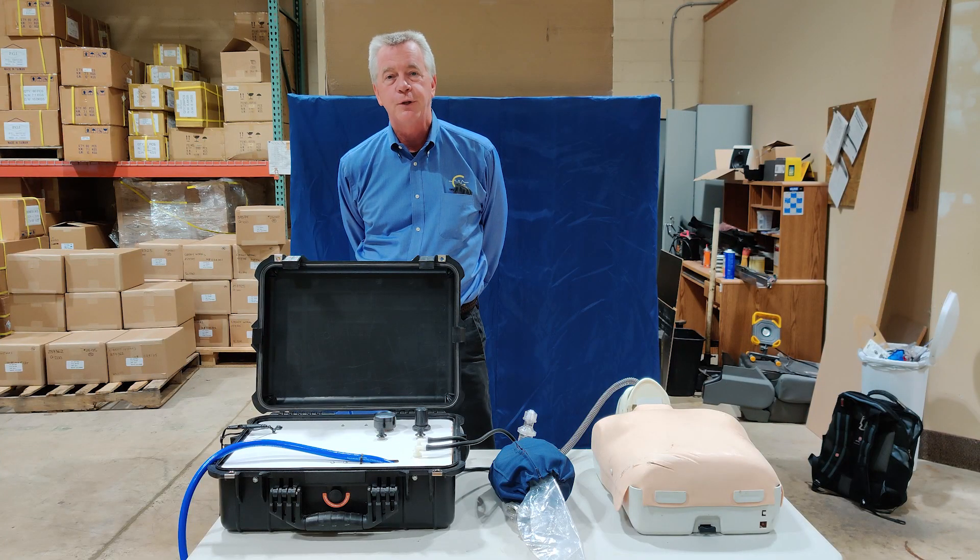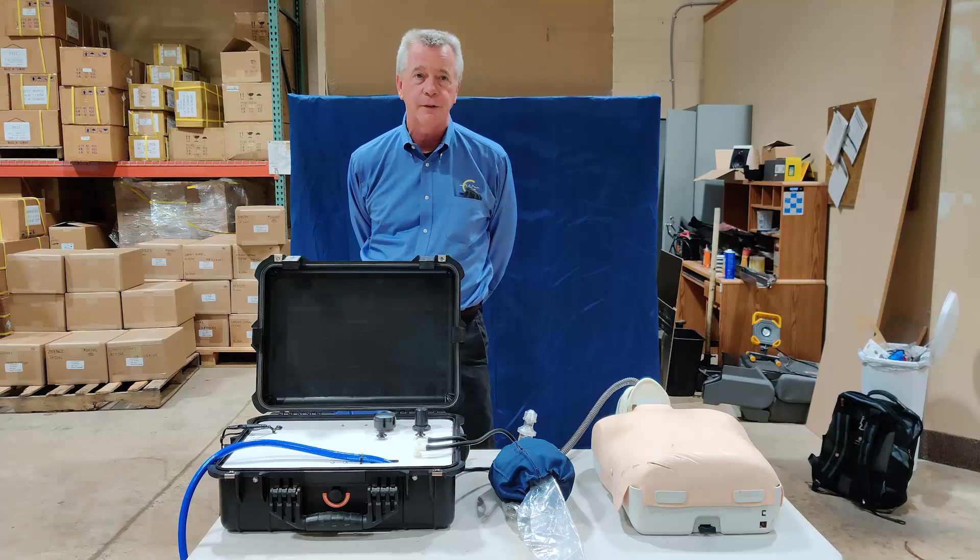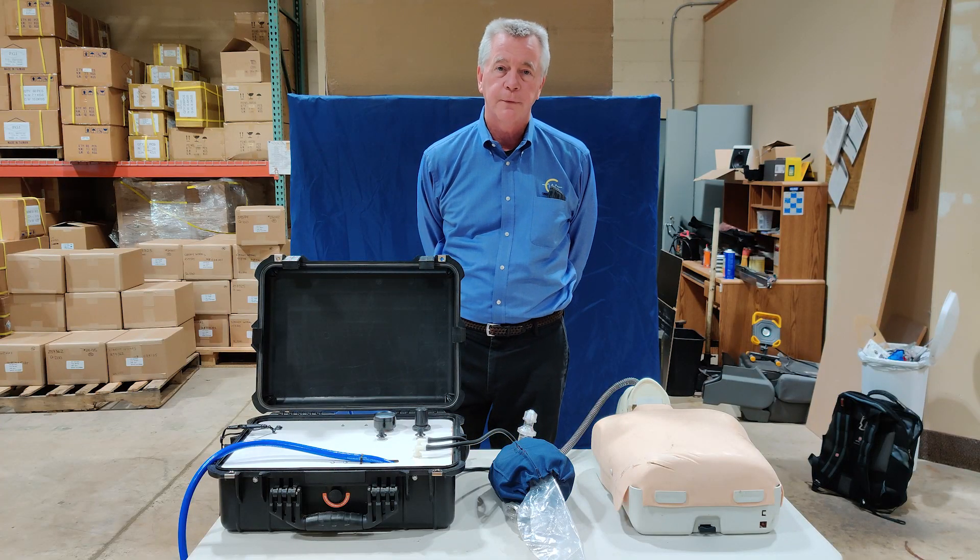Hi, my name is Dave Daly. I'm an engineer from New Jersey. I've been working with some other people on a low-cost ventilator to help with the COVID-19 crisis.